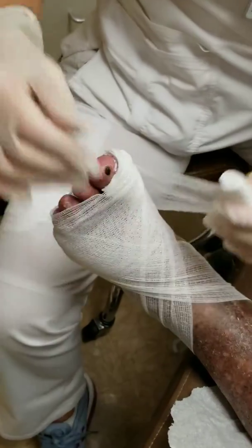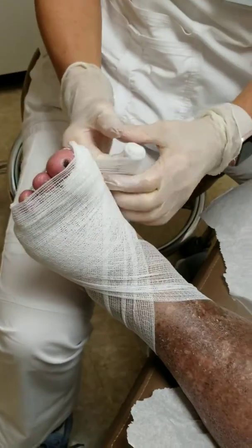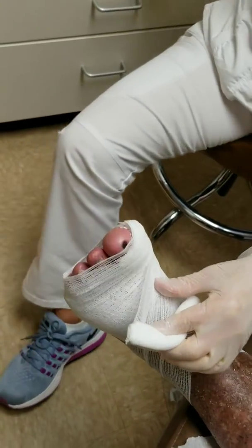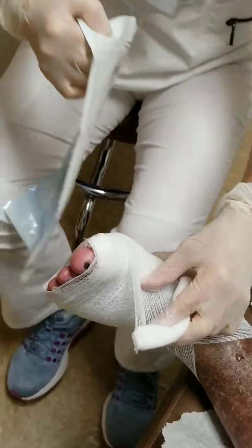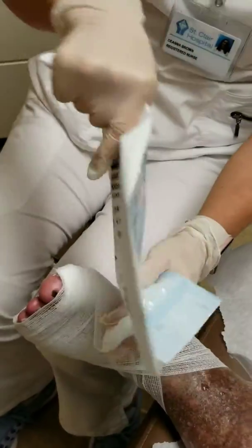The only thing I worry about is if you rip the tape on and off every day, you're going to start to break down his skin. So if his skin starts to look a little fragile, don't use the tape — use this instead.